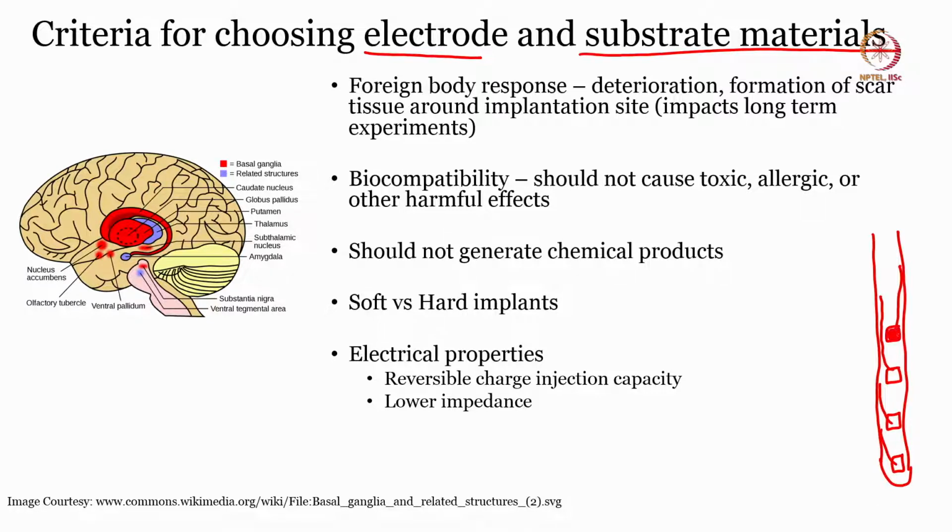Now, only this part that I am highlighting with the red is contact, meaning only this part can stimulate. Let me write it here: only this part can stimulate.